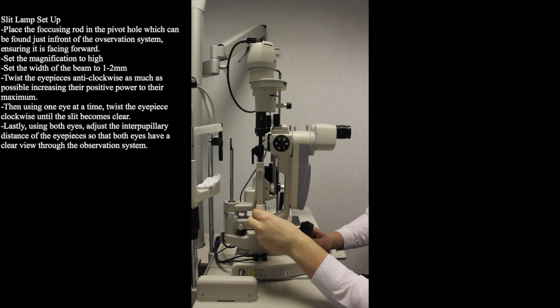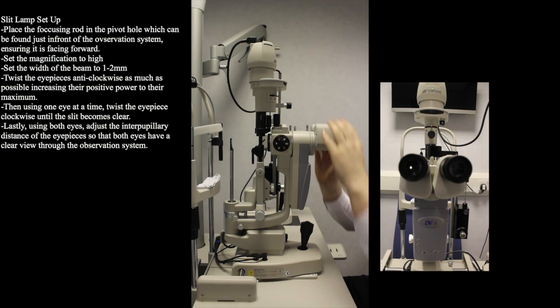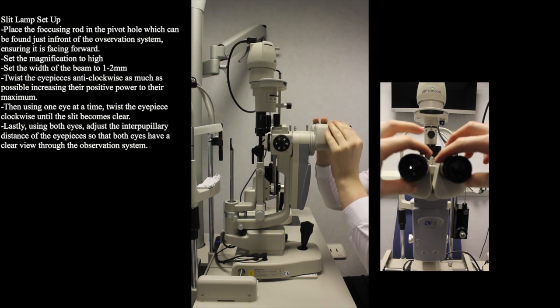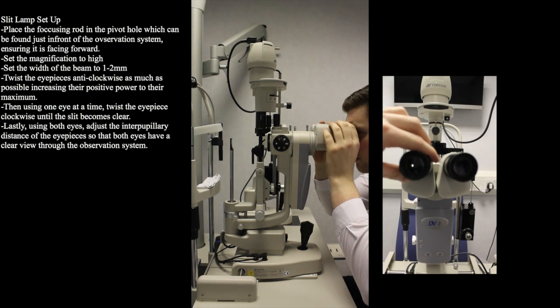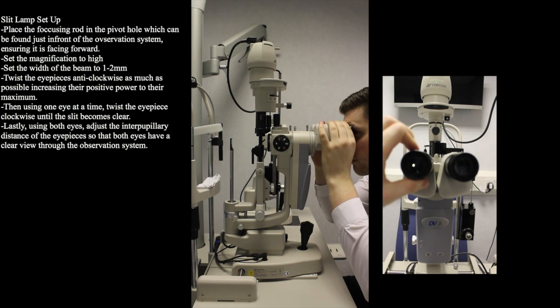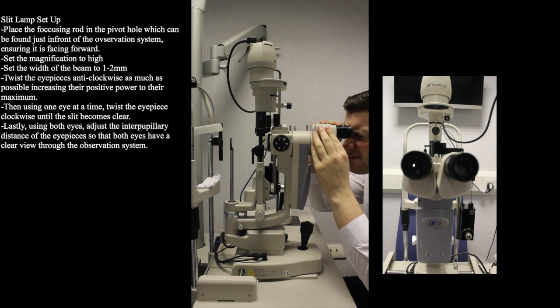We then must focus the eyepieces of the observation system. To do this we twist them anti-clockwise increasing the positive power of the eyepiece to as much as possible. Then using one at a time twist the eyepiece clockwise until the slit becomes clear.